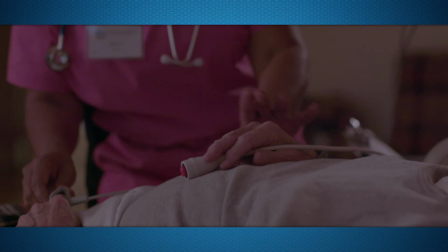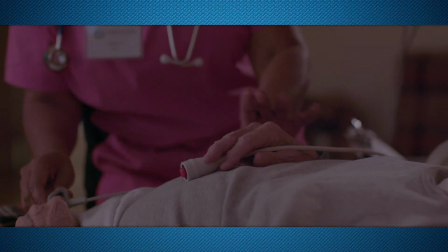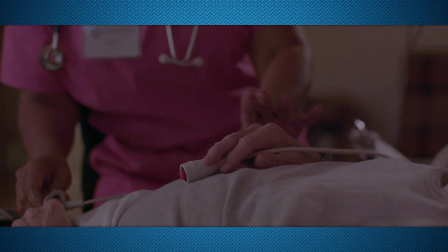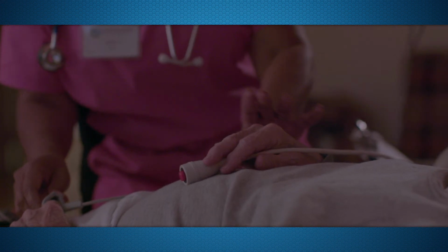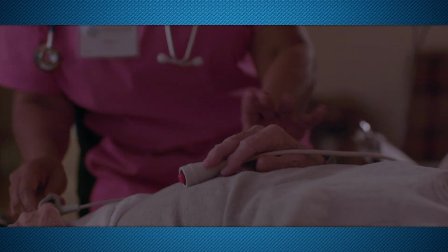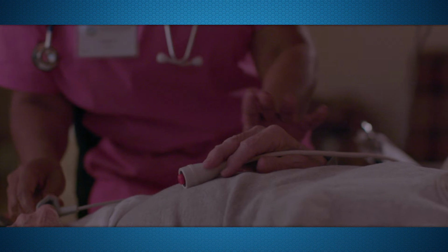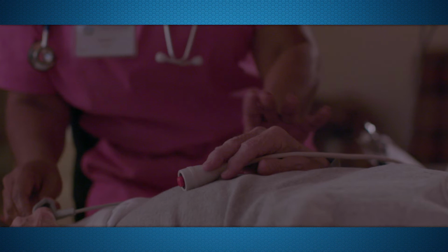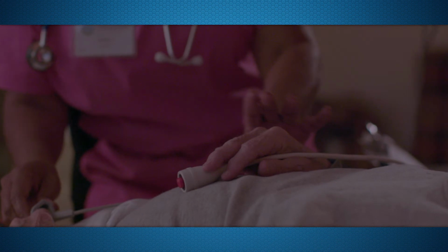Hypoxia is diagnosed using a process that measures the oxygen concentration in the blood. This is called pulse oximetry. Pulse oximeters work using a sensor. That sensor attaches to a finger, toe, earlobe, nose, or forehead. A reading of 95 to 100% is normal. A reading of 85 is not uncommon for those with chronic diseases.